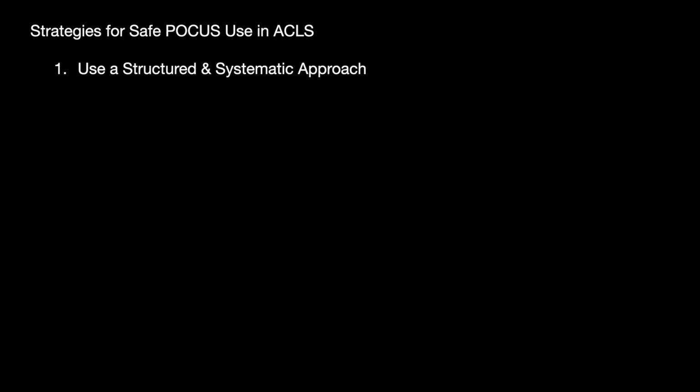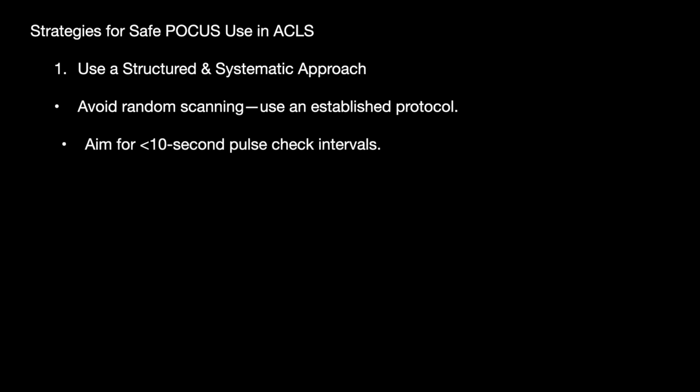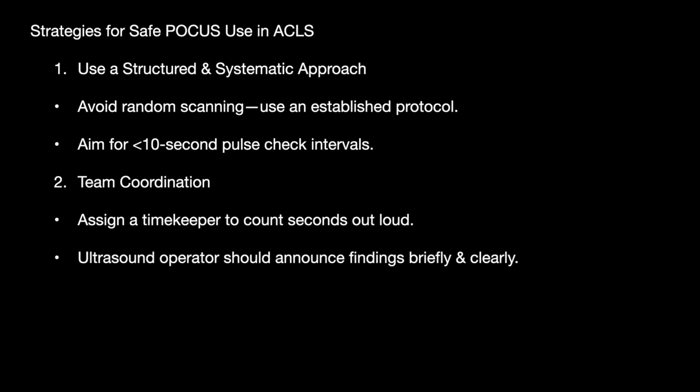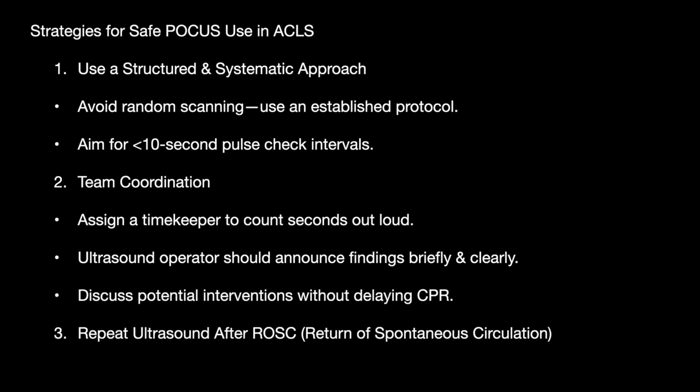So the strategy for safe POCUS should first focus on a structured and systematic approach: avoid random scanning, use an established protocol, and aim for a 10-second pulse check interval. Now, team coordination is important. Assign a timekeeper to check for these seconds, counting out loud. The ultrasound operator should announce findings briefly and clearly, and discuss potential interventions without delaying CPR. Repeat ultrasound after ROSC, which is very, very important.